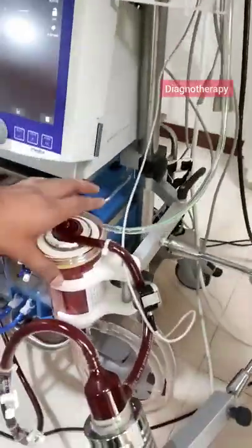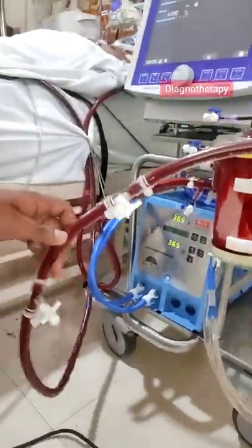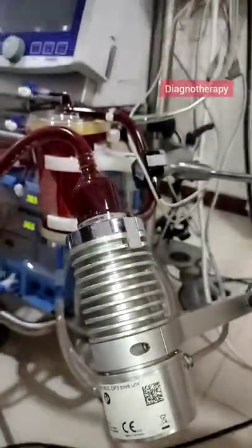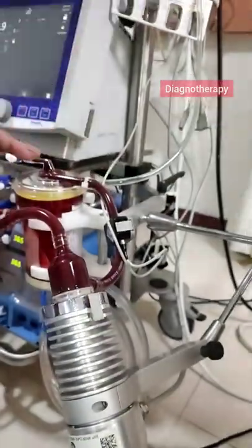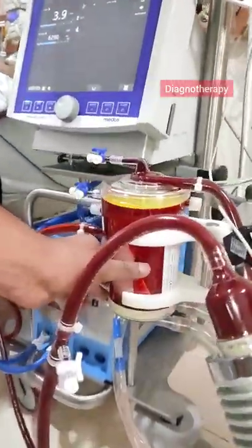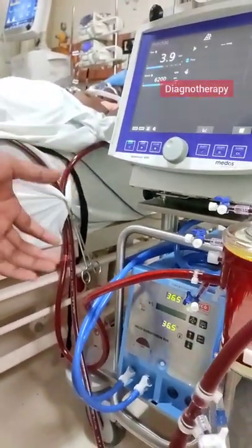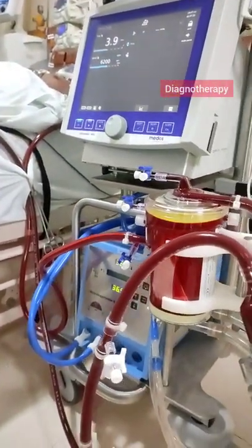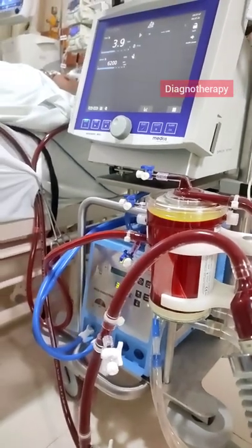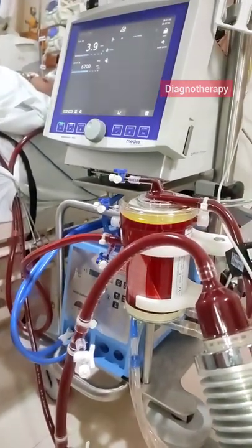In the blender the oxygen gets mixed. Here you can see the tubing from which the blood goes into the motor, and this has a peristaltic movement which further forces the blood to the oxygenator. From the oxygenator the oxygenated blood goes back to the patient, then back to the heart, which pumps the oxygenated blood to the body.